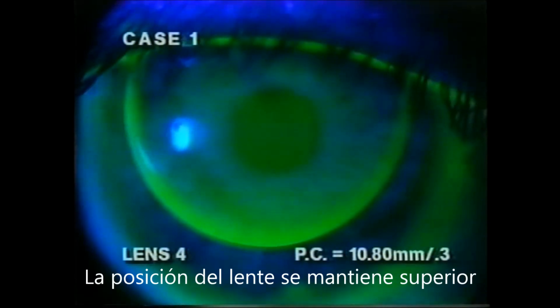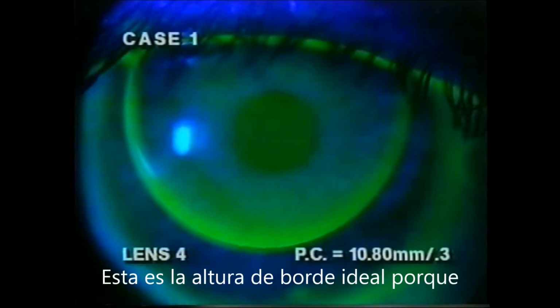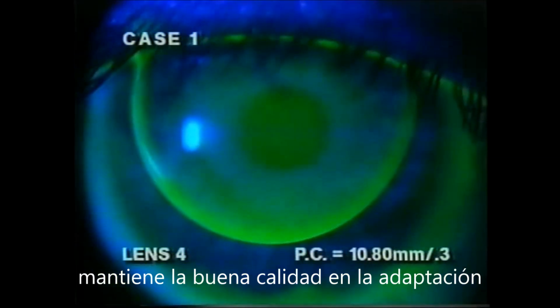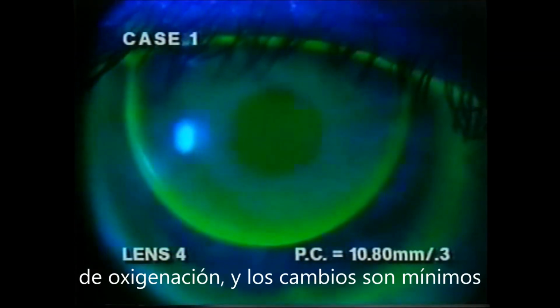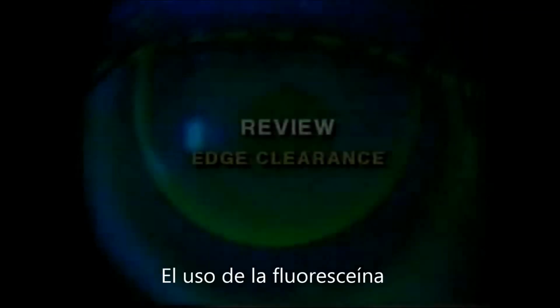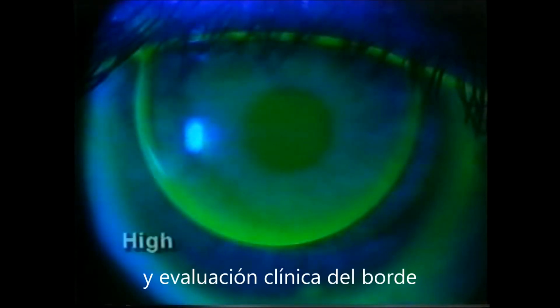The lens position is slightly superior, though still presents a good lens to cornea fitting relationship. The amount of edge clearance is optimum for tear exchange without compromising blink quality. This ensures good debris removal and oxygen delivery. The risk of lens seal-off and adherence is minimized. Use of fluorescein dye is very helpful for clinically evaluating edge clearance.